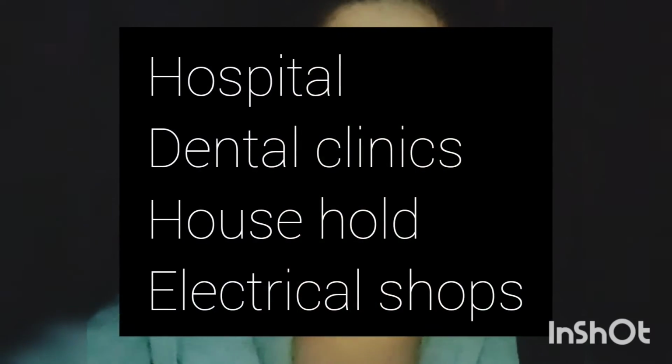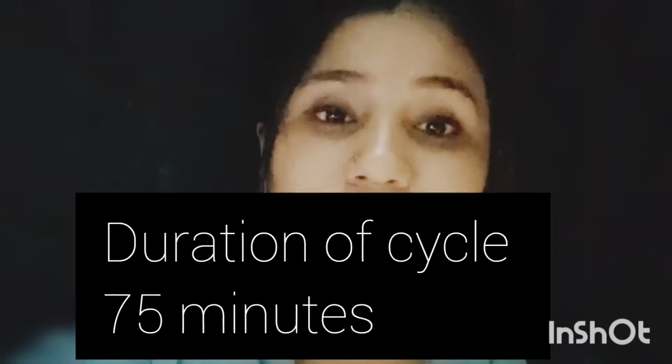The next point you should write is the application of gas plasma sterilization, that means where it is used. It is used in hospitals, dental clinics, and some electrical shops to clean electrical devices. There is a special device to do this gas plasma sterilization, known as a plasma sterilizer. A plasma sterilizer is a special device used for doing gas plasma sterilization.